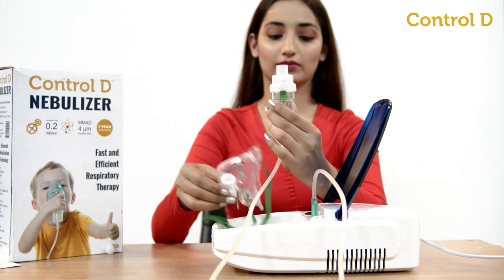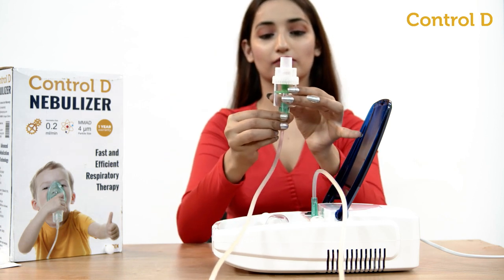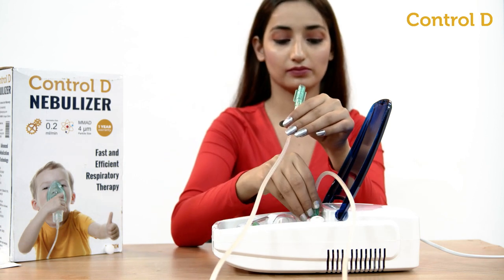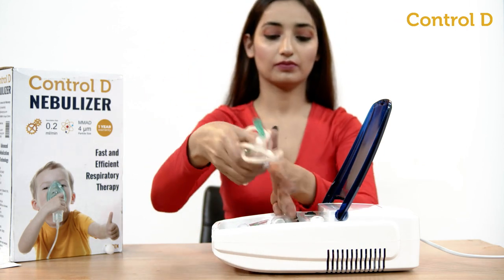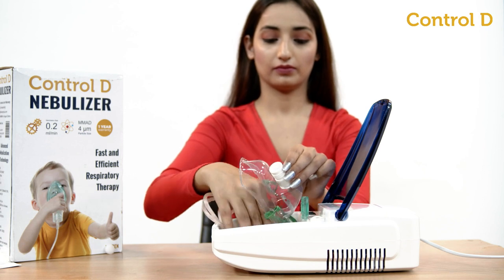Detach the mask from the medicine chamber. Remove the air tube from medicine chamber and compressor. Repack all the contents back in the nebulizer storage.